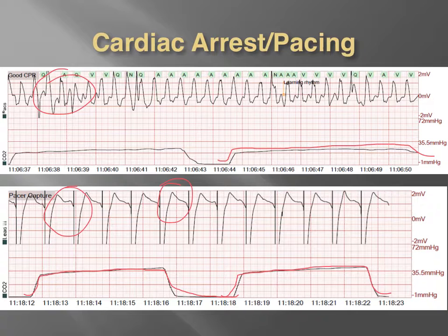But what is our body doing on the downwind effect? What I mean by that is, what kind of carbon dioxide production is that body producing? That gives us a better indication that oxygen is getting to the tissues and is being processed appropriately. Because if the oxygen is not getting to the tissues, the body won't necessarily produce carbon dioxide. It'll produce something like lactic acid instead. So this is a good indication, one, that she maybe wasn't down very long, and two, that she's still savable at this point in our minds.